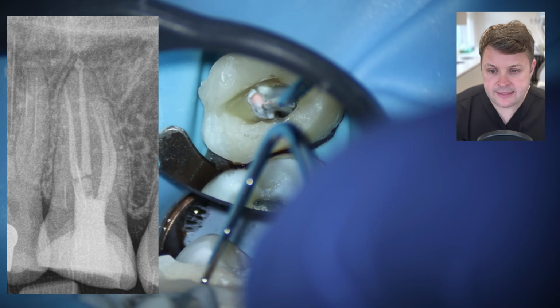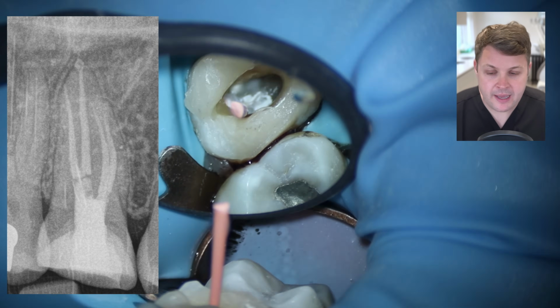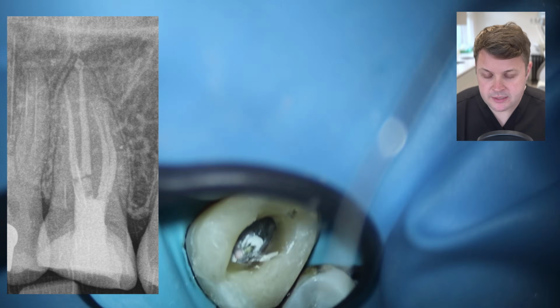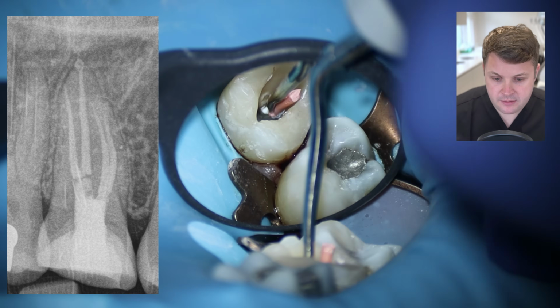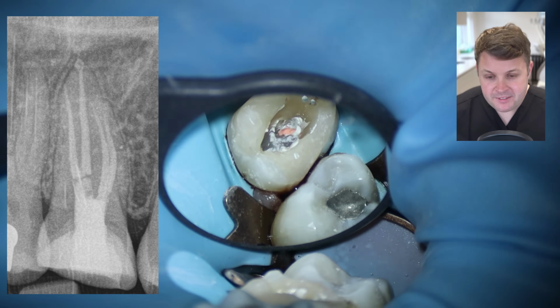When we look at our post-op radiograph, it looks amazing. I'm absolutely over the moon with this, really thrilled. It's all nicely to length. We've got 4 obvious canals there, and it looks fantastic. And overall, that's the case.